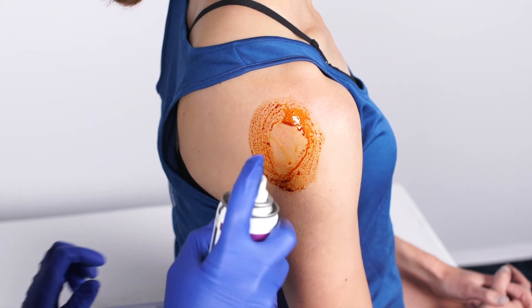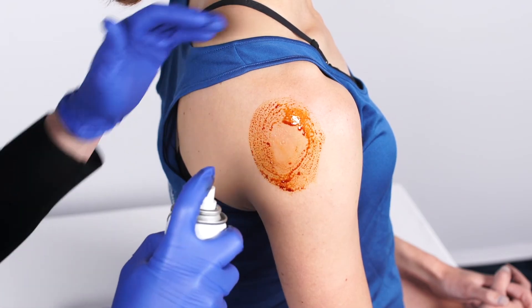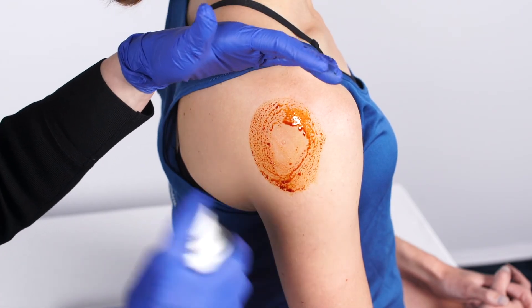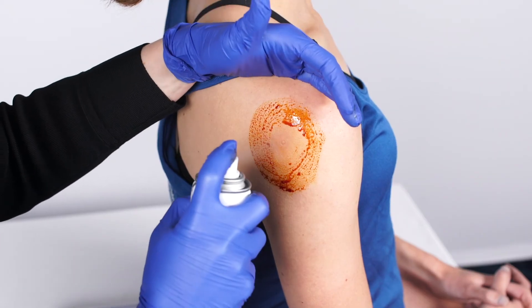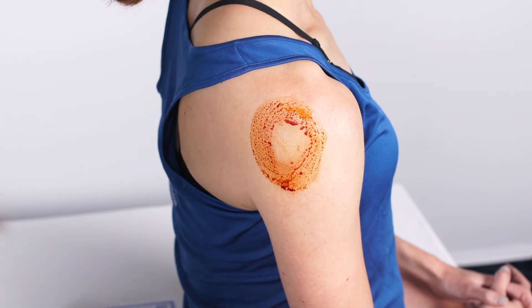Next, spray with ethyl chloride to freeze the skin and provide a little bit of anesthesia. Warn the patient that this might feel a little cold and a little burny. I put my hand here just to shield the patient a little bit. Sometimes you'll also get a little dripping down below, which is okay.